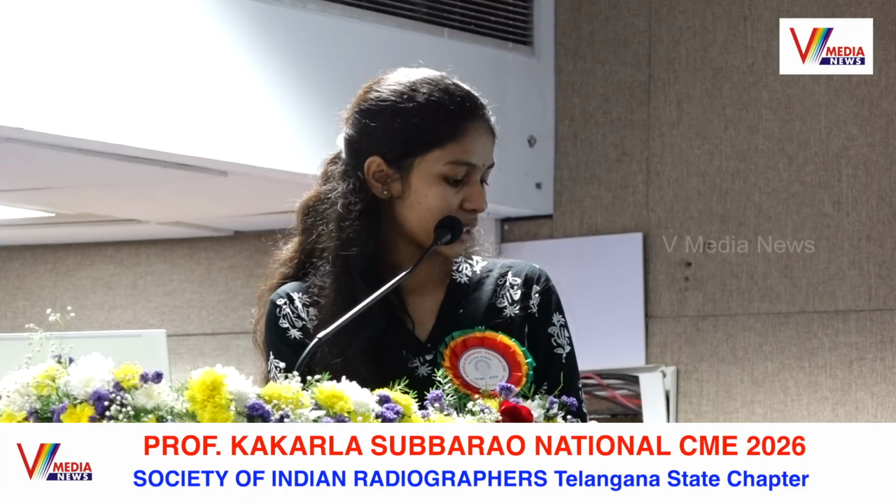Next, MR spectroscopy. It is important to know the metabolites. The brain consists of a few metabolites: choline, creatine, and NAA, N-acetyl aspartate. These are the key metabolites we have. If there is an abnormality in the brain, mainly in brain tumors, we can see a change in these ratios. In the image we can see a glioblastoma.